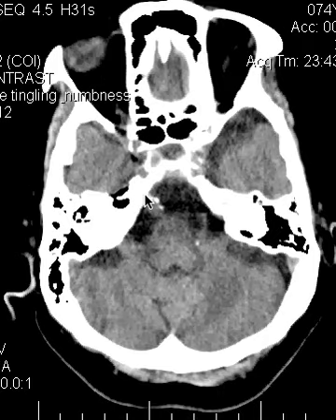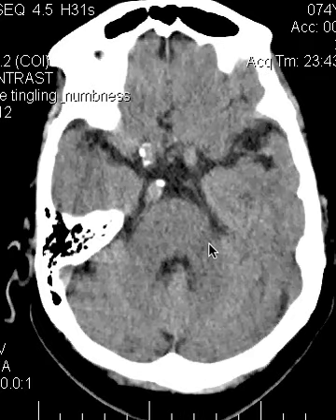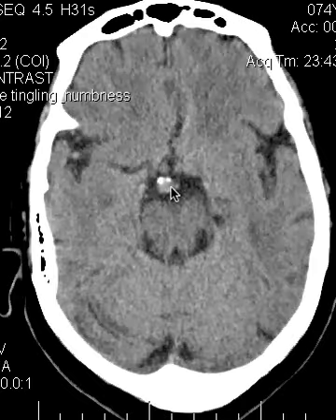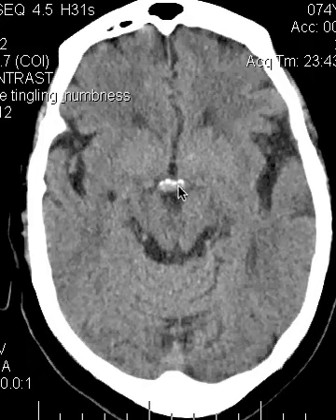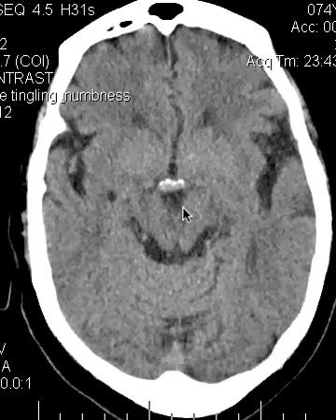Now, the basilar artery is swinging around. Here it is at this level. This is the level of the medulla. And then when we get to the level of the pons, it's still off on the right, a little big. Okay, now follow it up higher. Calcification there, it's in the prepontine cistern. Now it's getting closer to the midline, near the interpeduncular cistern. And then here it is up higher at the level of the interpeduncular cistern. Here you see the cisterns, the interpeduncular cistern and the two cerebral peduncles.